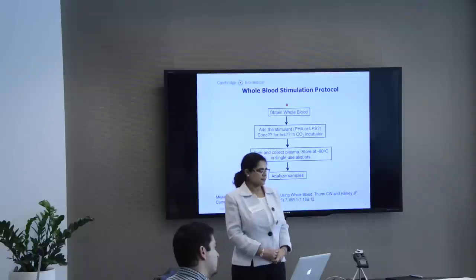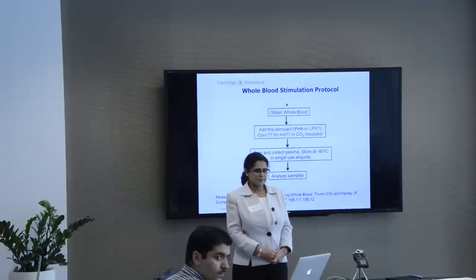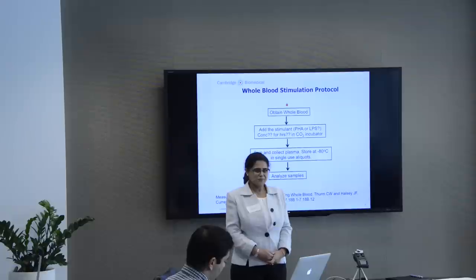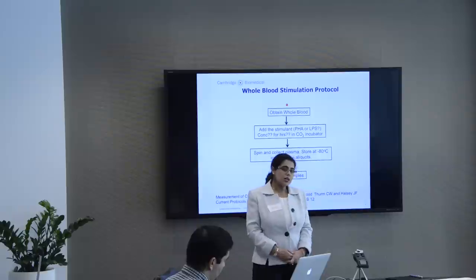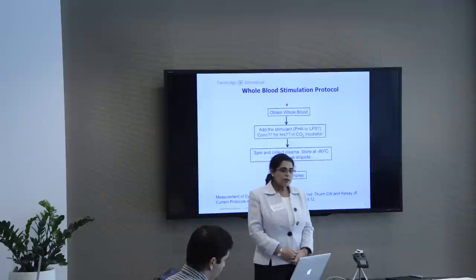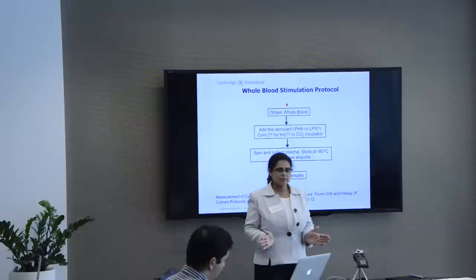Along the same lines, why do you think you're able to store the stimulated plasma or serum and not have a freeze-thaw problem, versus the recombinant proteins that you spike? Yes, because these are naturally produced, and they actually mimic the real situation. Whatever cytokines are produced within that matrix remain stable.